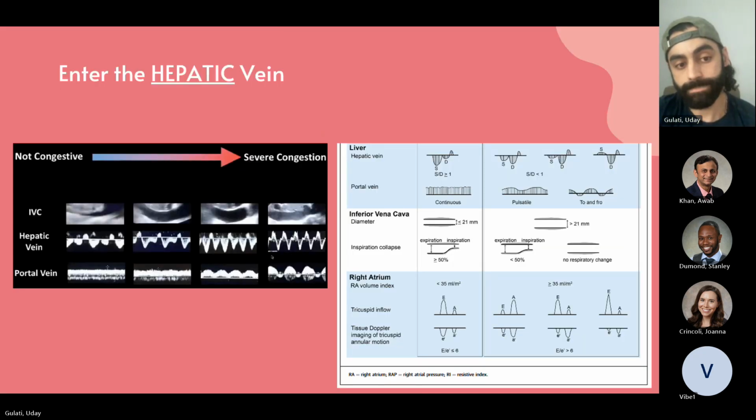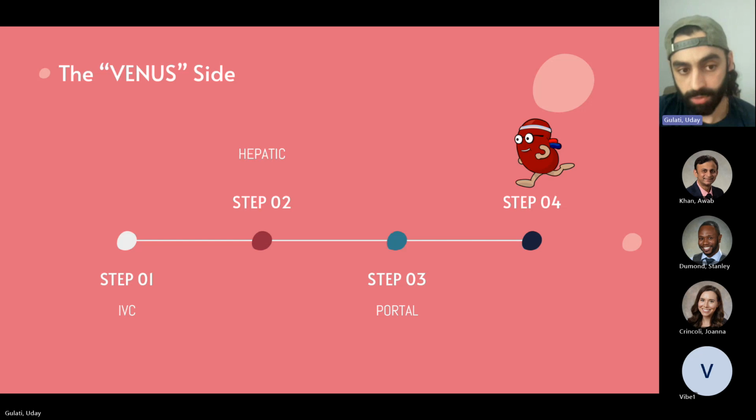And so we talked about, and I can send you guys the flashcards of this. As you do it over and over, you'll start to remember it. But basically these images, what's grade 1, grade 2, grade 3. And so we talked about the portal vein.